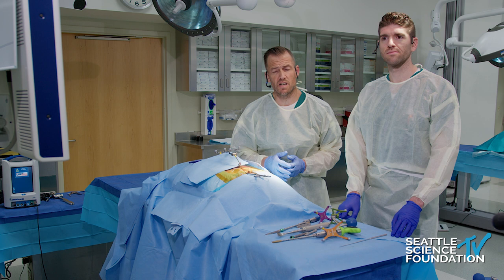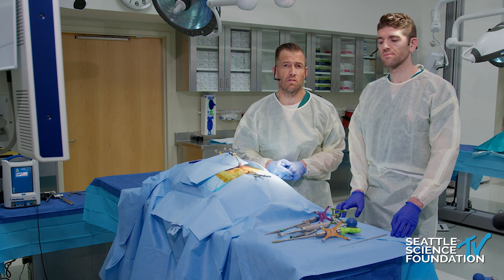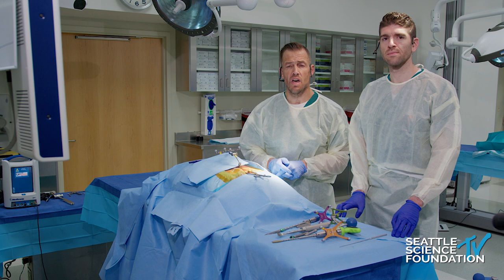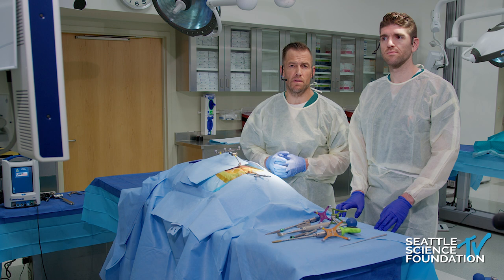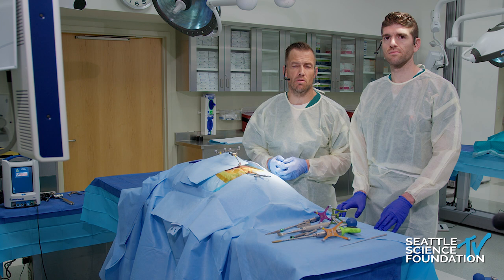Anyone familiar with an S2 alar iliac trajectory screw is not going to have tremendous problems placing one of the granite devices or even the bedrock device, as the trajectory is very similar. The major difference is making sure you have enough bony real estate to receive the implants placed within the pelvis. When looking at our teardrop image with more distal fixation, we want to be in the lower one-third of the teardrop to reserve room for supplementary fixation above.